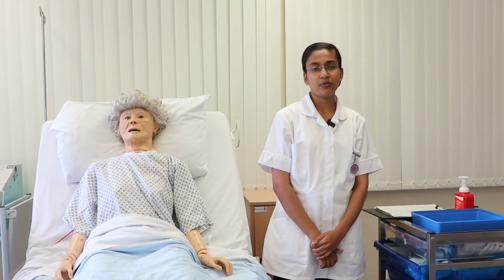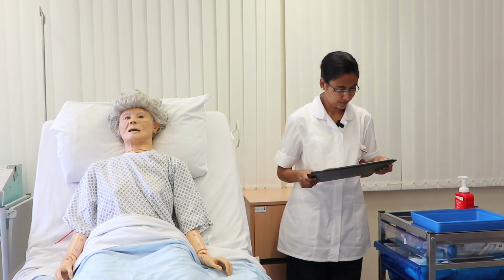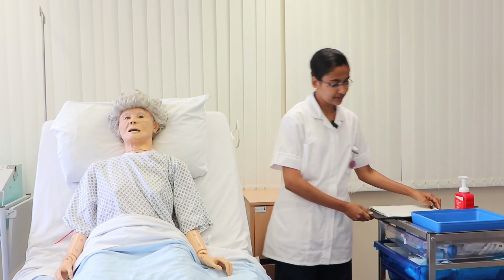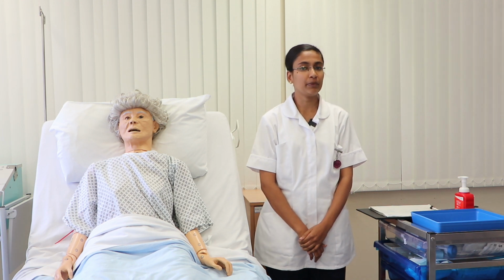Today I am going to perform administration of inhaled medication for my patient. Before that I will see the scenario. Once I have done with the scenario, I will check that the scene is safe, free from any spillages, cords, cables, cutters that may cause harm to me, my patient and others.